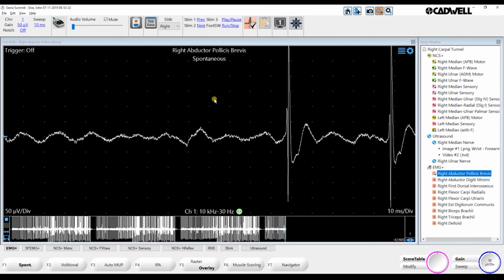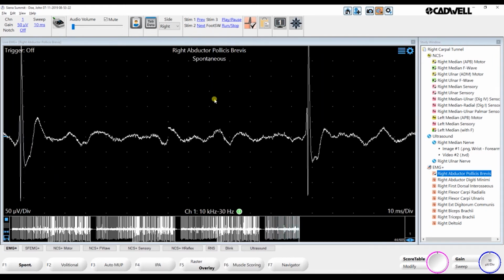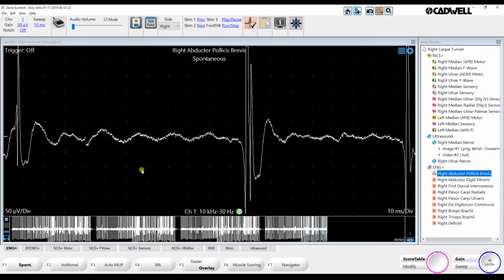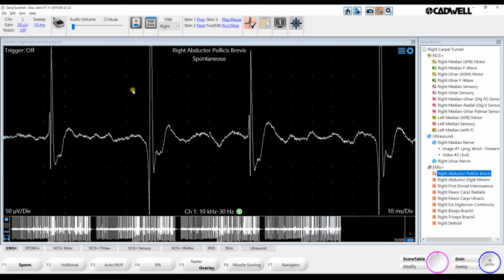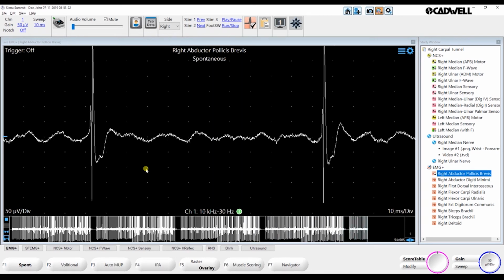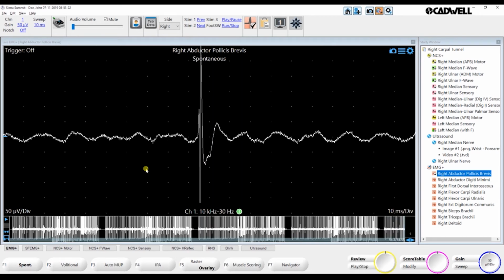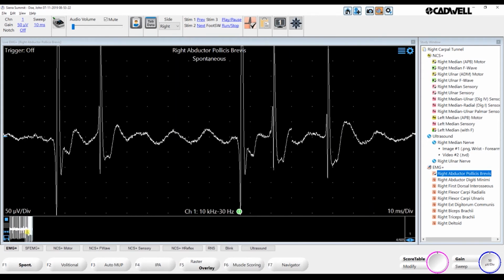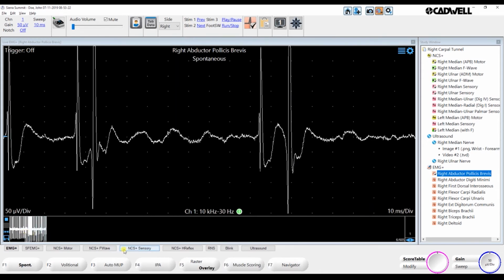Second, we want to make sure that the image is clear and consistent. So you have full control over the background grid, over how the image is displayed. When we hit stop, you can pause, and you'll notice down here at the bottom this is a buffer. So I'm going to run again, and you'll see that this is our buffer, what we've been running so far. I have it currently set to a 60-second buffer.